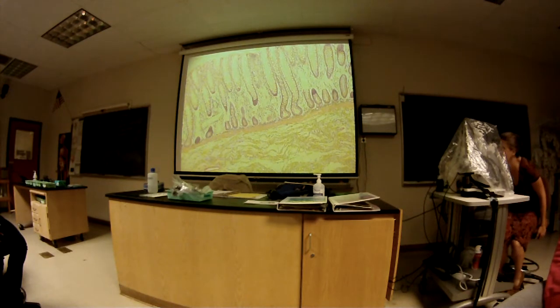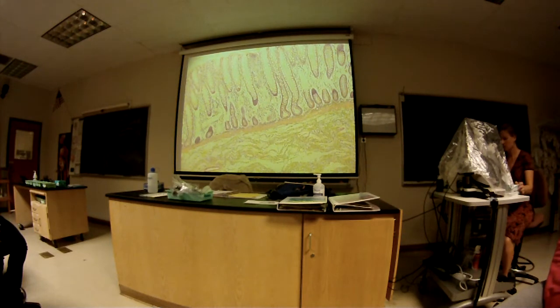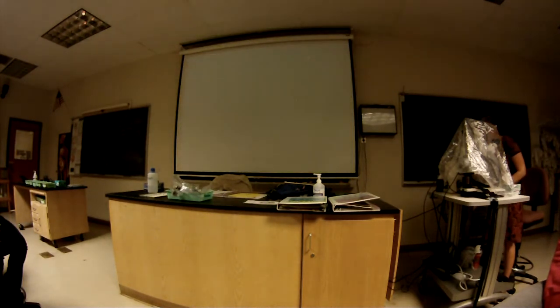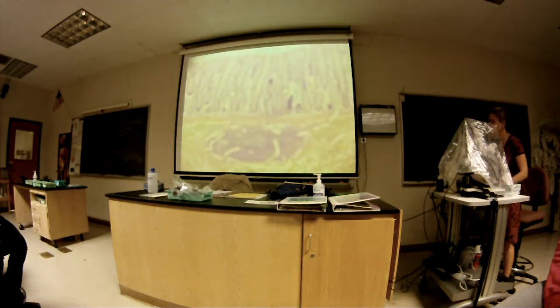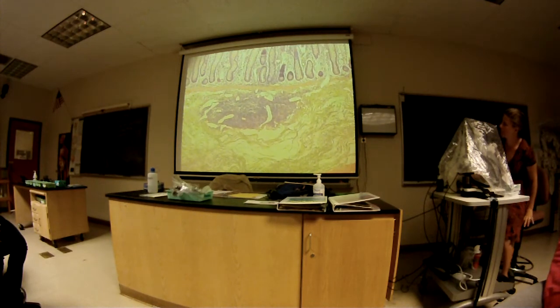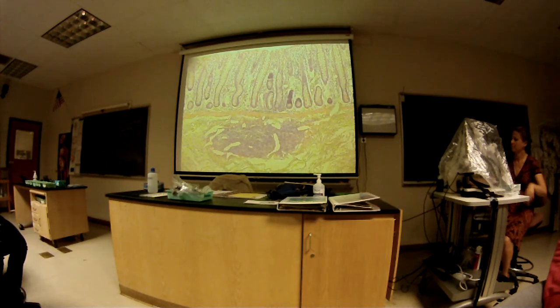Good. And what kind of epithelium will you see in the mucosa? Simple columnar. Good. And let's see if we can find a lymphoid nodule. You see it? And that's the submucosa. Okay, so here's the lymphoid nodule.